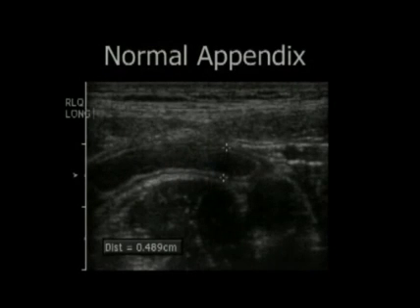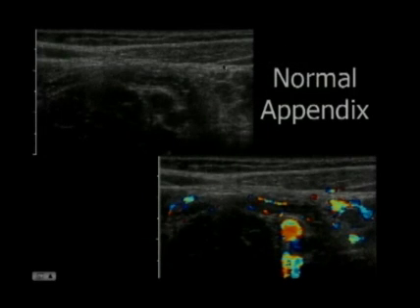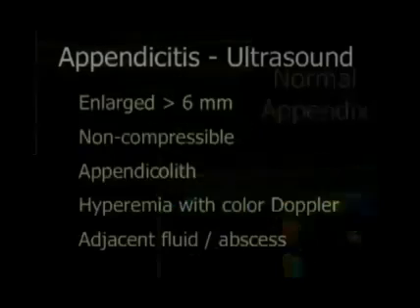This one, while you may think it looks more concerning, remember they can fill with fluid. And in the old days doing barium enemas, remember that most normal appendices, 90%, fill with barium. So it's okay to have luminal contents. Again, normal GI wall, you see the layers well, there's no surrounding hyperemia or inflammatory change. This is just a normal appendix. Another one, the degree of hyperemia really depends upon your machines, and with technology changing, what's normal is a constantly moving target. So you have to be aware of, with your own equipment and your own particular transducers, what a normal amount of blood flow should be within the appendix.